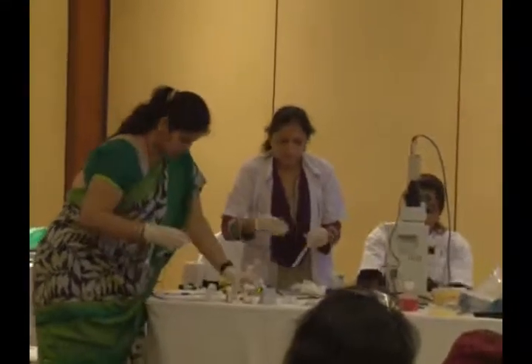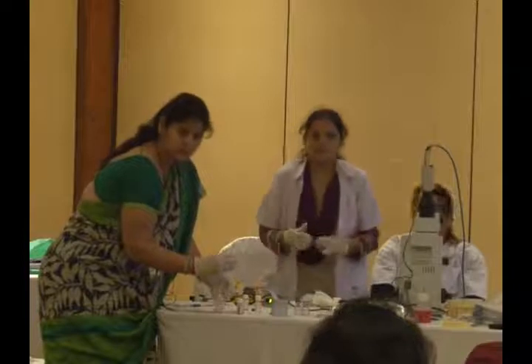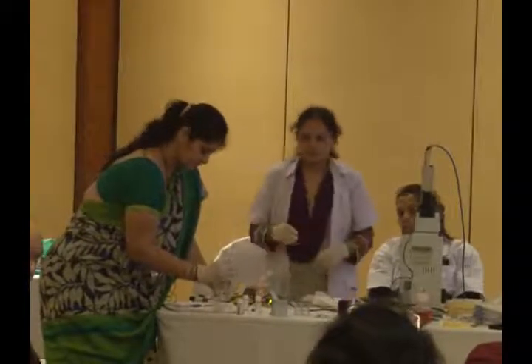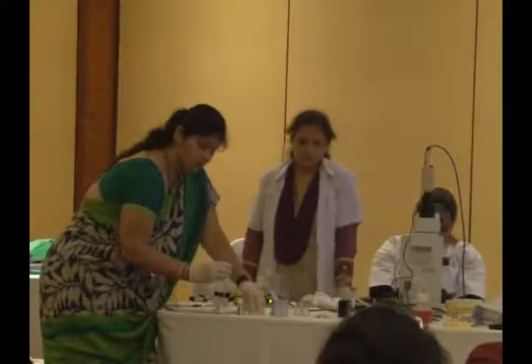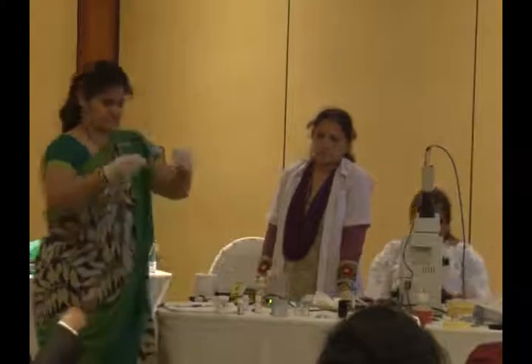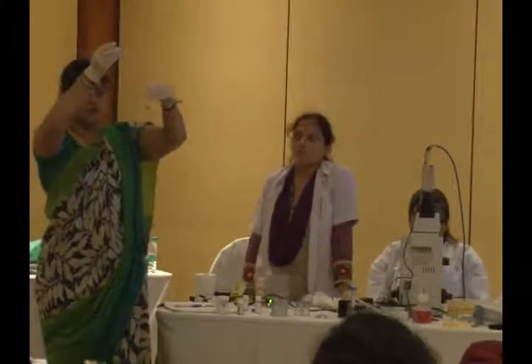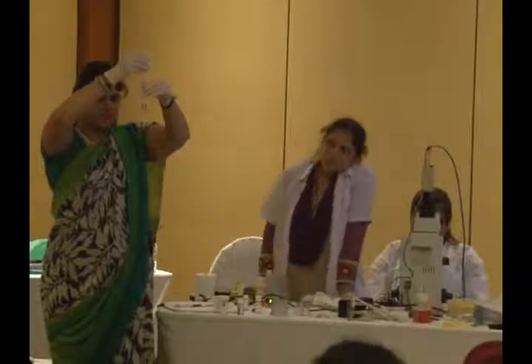Now we put the semen sample, mix it properly. It depends on how you load it. Now if you load it differently at the interface. See, now we take the sample at the top of the tube. So there will be 3 clear layers.